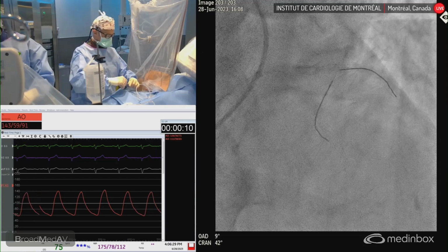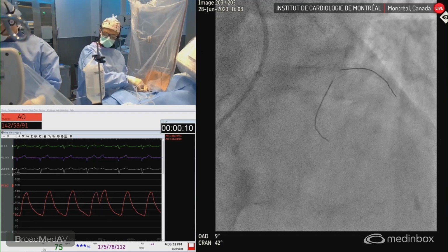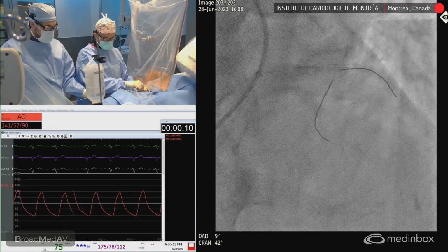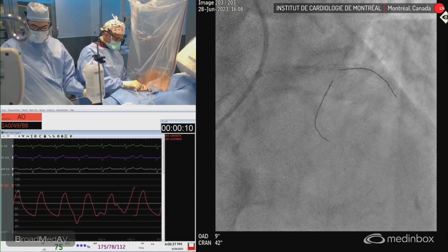I use a thumb of rule for the proximal size, 2.5. Point fixe, s'il te plaît, Quentin. Point fixe is 2/3 of 5, so that's okay, let's go.